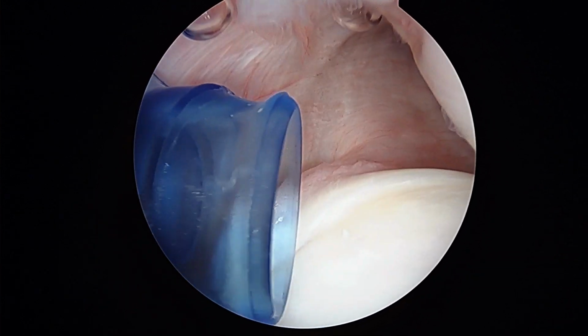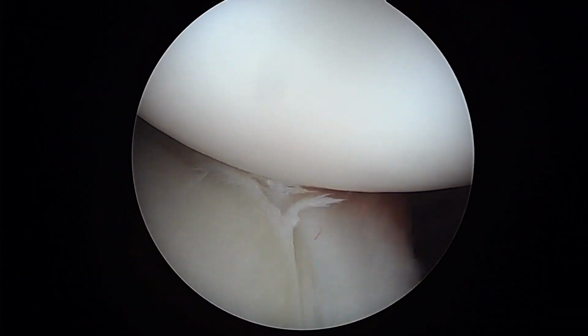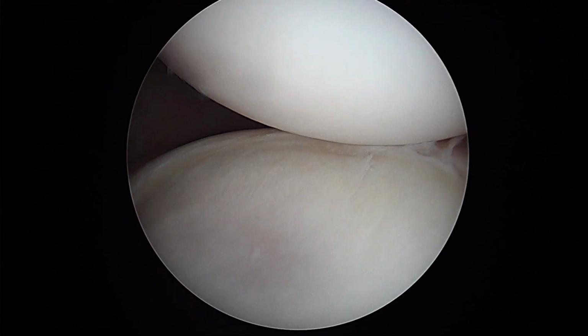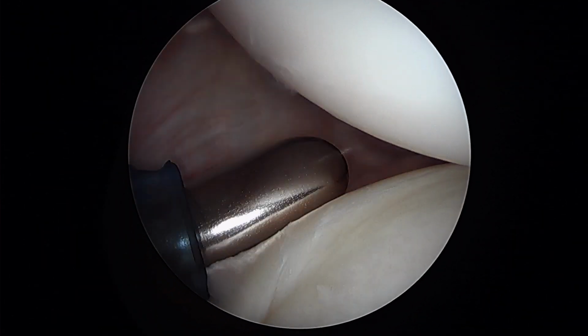Okay, so now we're looking from the front. This blue cannula is coming in the back of your shoulder. As we look down the front, you can see, just lift up on the arm a little bit, guys, straight up. As we lift up on the arm, you can see the anterior. There's a little bit of a band of the anterior inferior glenohumeral ligament, but not much.